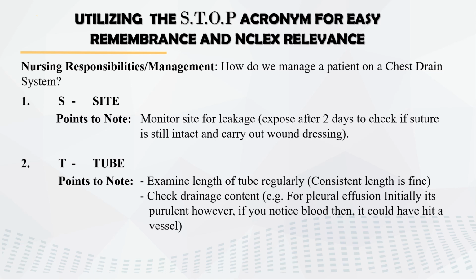So for the site, there are points to note. We need to monitor the site for leakage. After the first incision, the first day of incision, 2 days is usually given. Then we check the suture. We want to check if the suture has not eaten into the skin, right? We want to check that there are no infections. Then you check if the suture is still intact, and then you carry out wound dressing. There is need to check the wound, okay, to prevent infections.